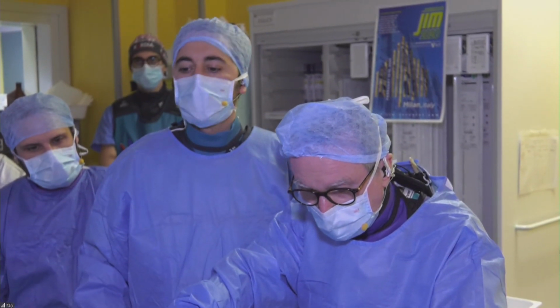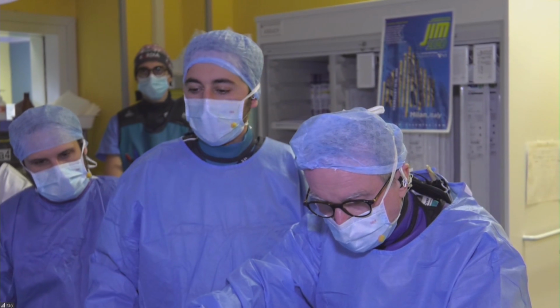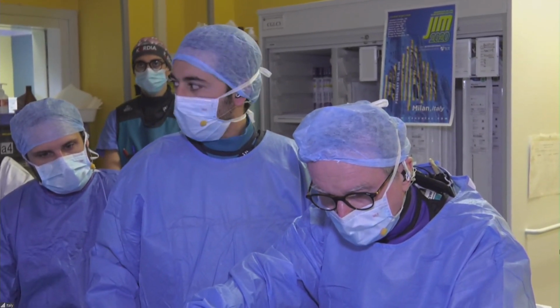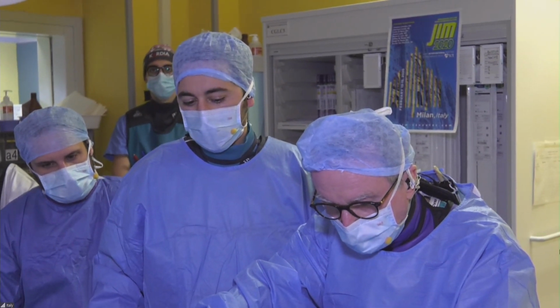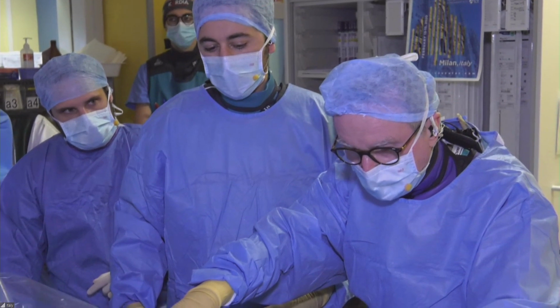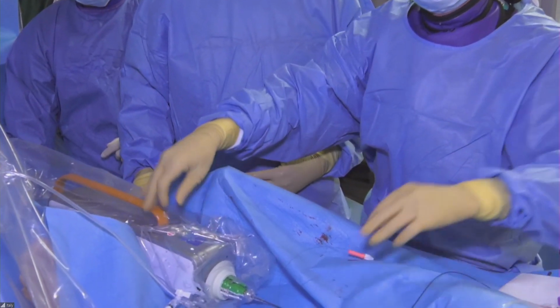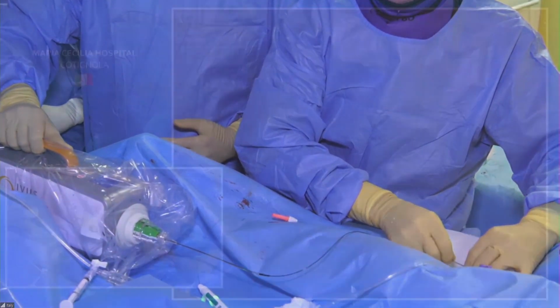The trial just demands FFR measurement at the beginning in order to decide if the lesion needs to be treated. So this business of measuring FFR at the end is something we are doing because we want to check.